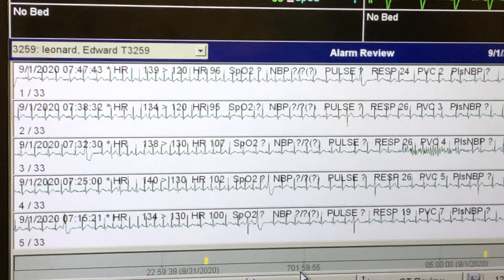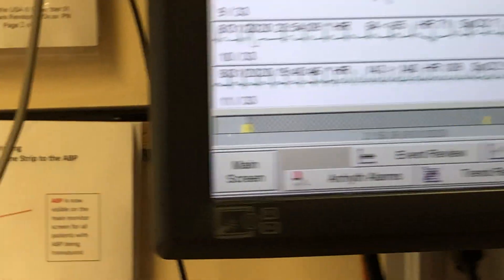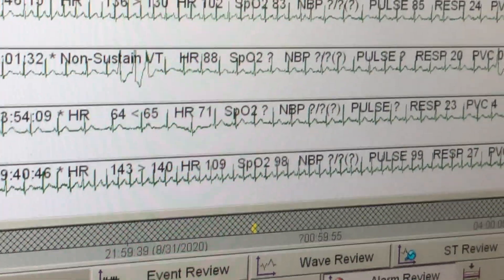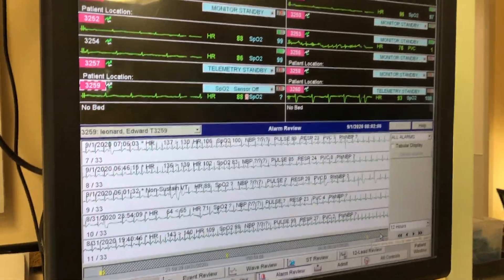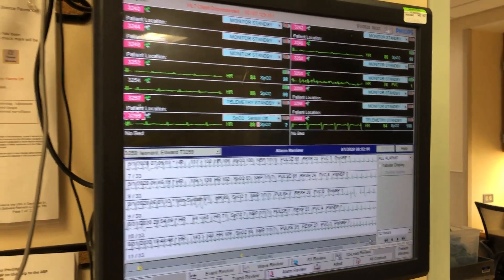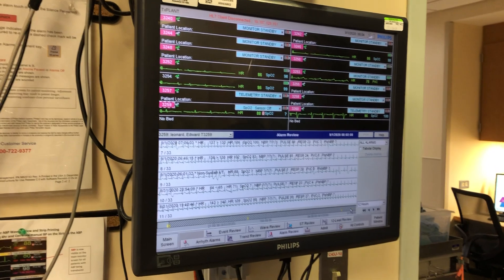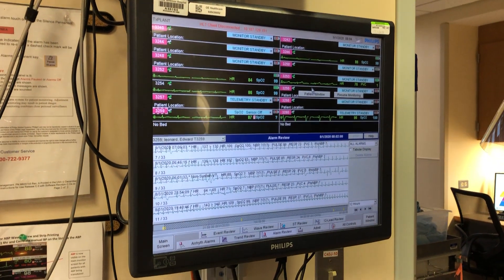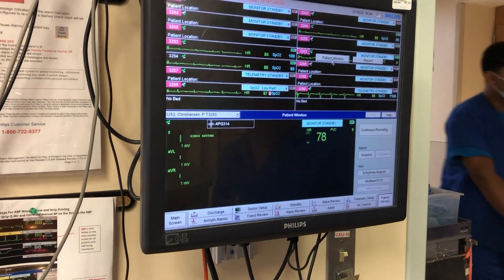A lot of doctors coming in the morning don't look at this. When you click on it, you see yellow alarms showing what happened. Red alarms we always respond to — nobody can ignore them, there's no silencing, you have to respond. Most red alarms are things like leads off, desatting, SVT, or tachycardia. We don't see that many red alarms beyond those.